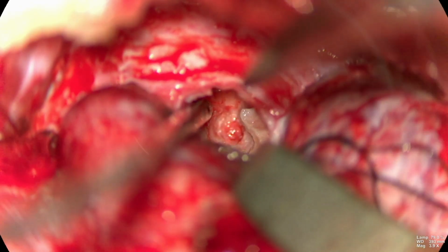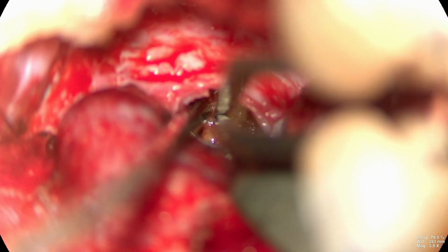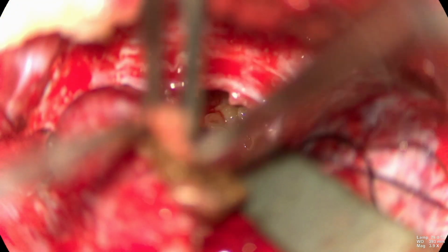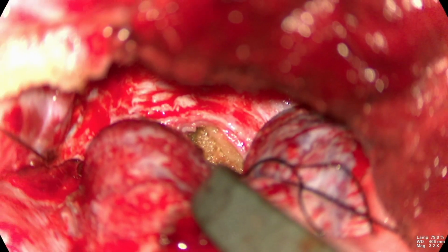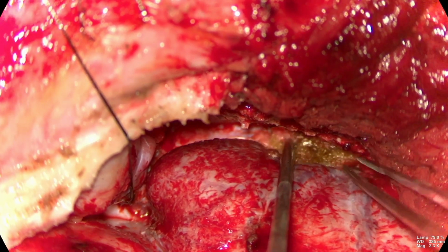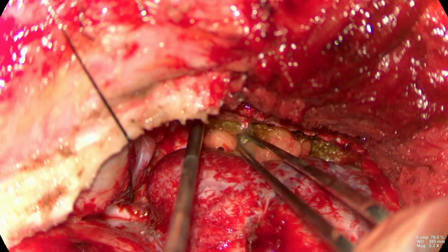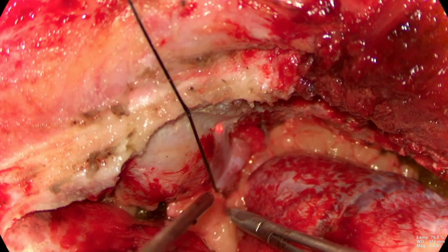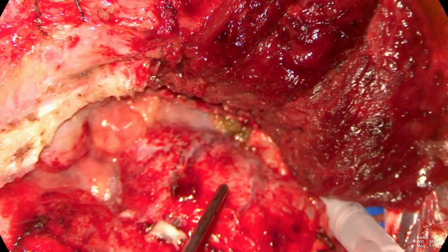So after safe removal of the soft component and then some part of the solid component, repair was started by putting small fat pieces wrapped with Surgicel. Then the dead space created between the dura mater propria of the temporal lobe and the cavernous sinus membrane was filled with these small pieces of fat. Fibrin glue was put over it.